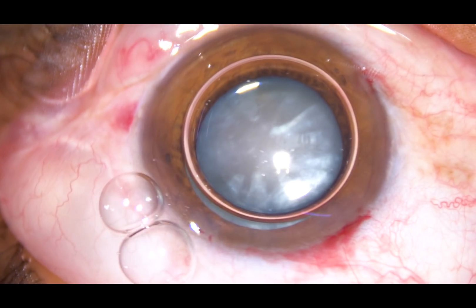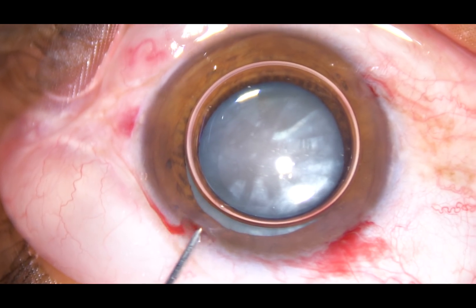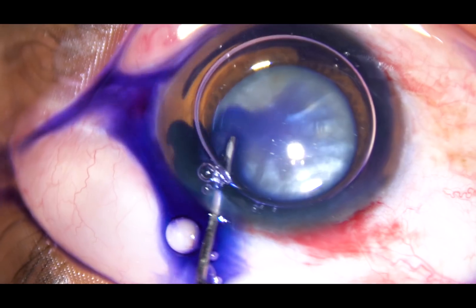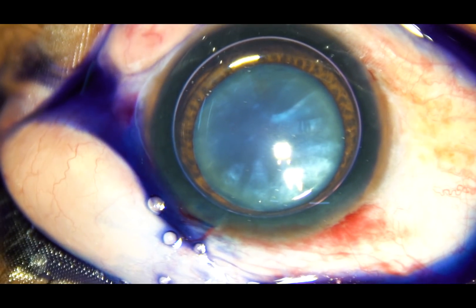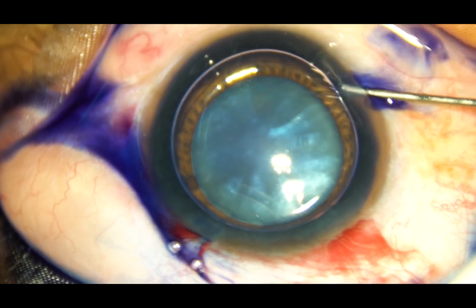This is an air bubble. The plan is to stain the capsule underneath this air bubble. And here goes the dye — trypan blue 0.06% dye is spread all over the anterior capsule. And at the end, a concentrated amount is placed over the capsule.